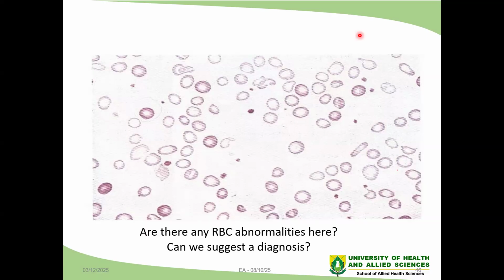The middle space is wider in this picture. Okay, so you want to say that in terms of the population of the red cells on this film, they are markedly reduced. That's why you have the white spaces in between the cells. That's a very good observation.